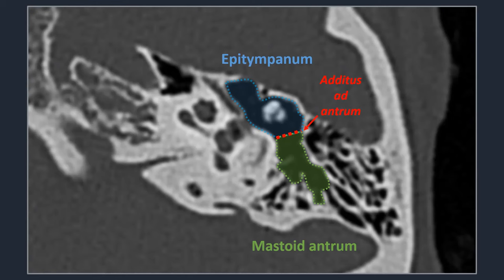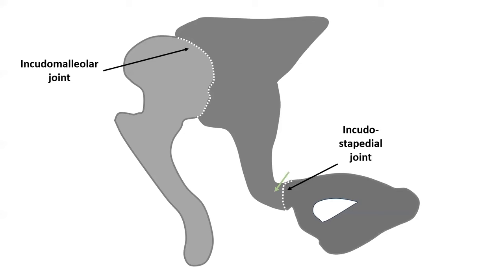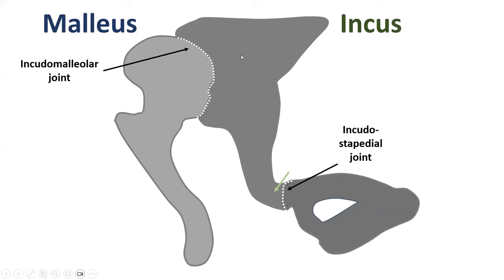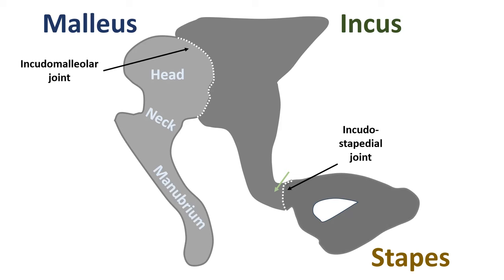The ossicles consist of the malleus (the hammer), which articulates with the incus (the anvil) through the incudomalleolar joint, and the stapes, which articulates with the incus through the incudostapedial joint. The malleus has a head, a small neck, and a large handle called the manubrium or manubrium. It also has a short anterior process and a lateral process, which attaches to the eardrum.